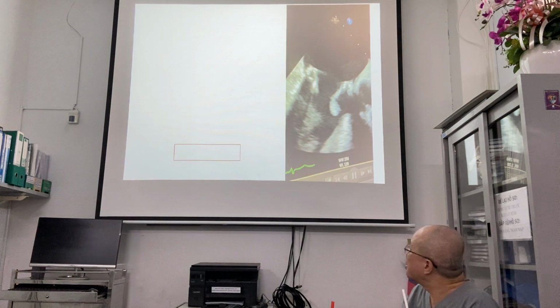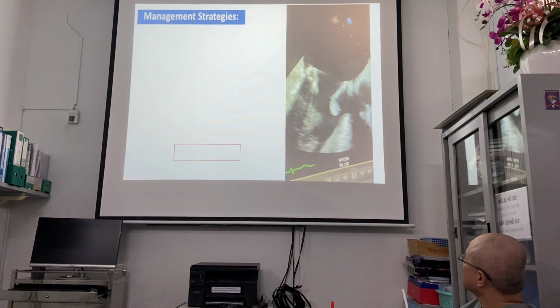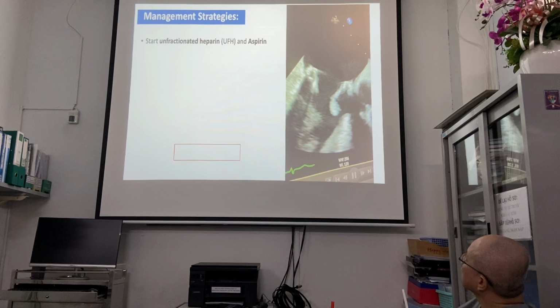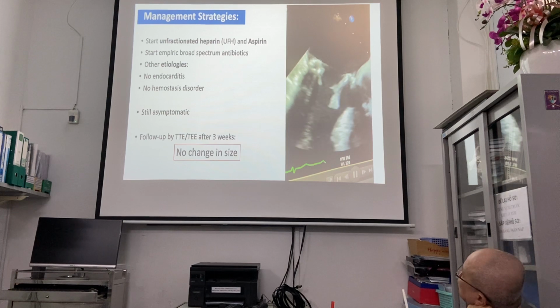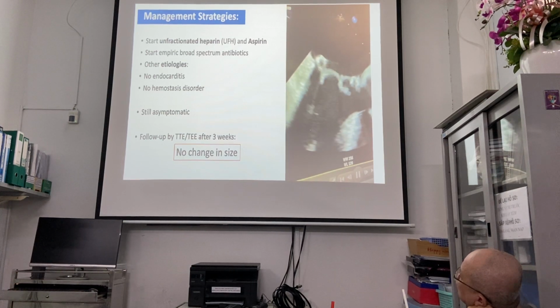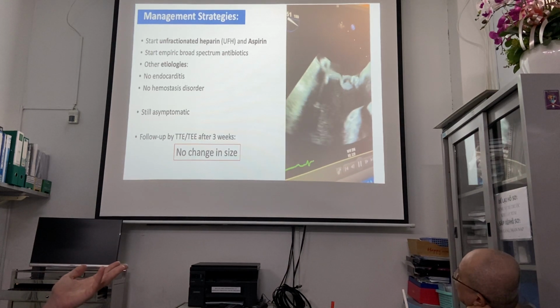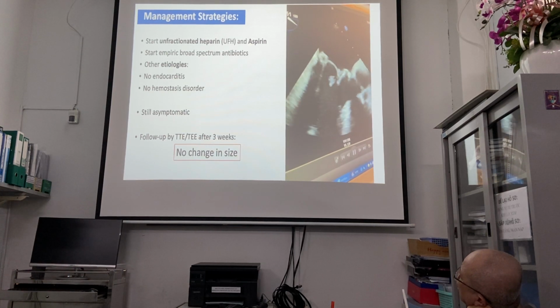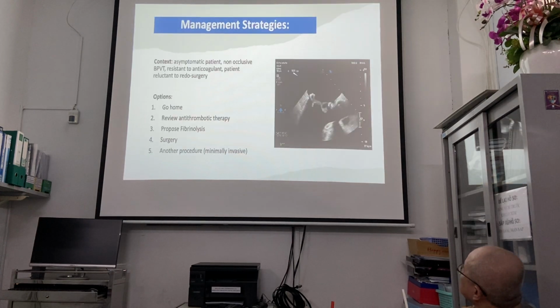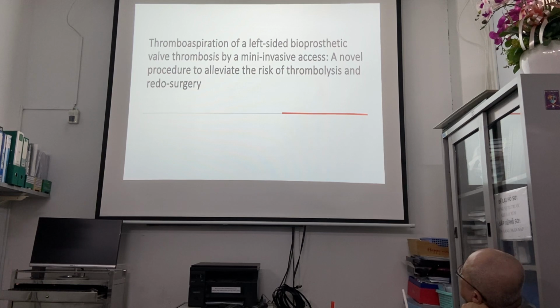So now, of course, it is not possible from transeptal to aspirate this. So what the surgeon told me is a bit crazy, but when I came back on Monday, they had scheduled the patient for me, but they didn't ask me if I agreed. The surgeon said, I go transapical, and then you use the catheter, and then you aspirate. So yeah, the patient was on the table before I could give my opinion. So this is what we did.